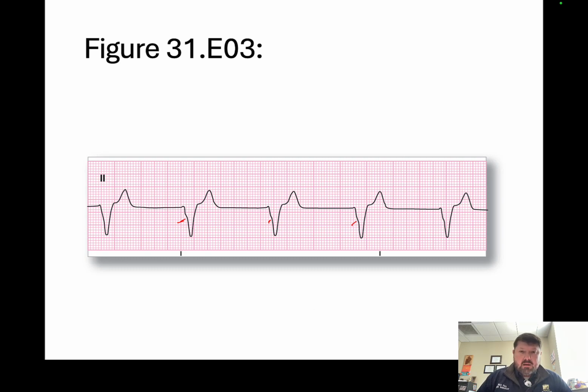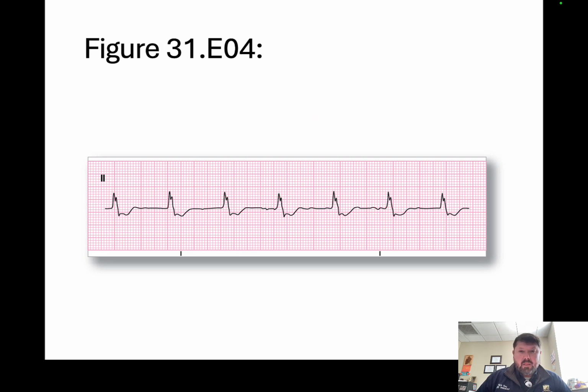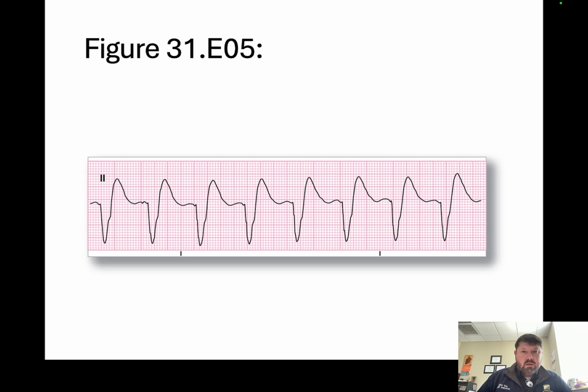So we've got another idioventricular. Wide complex with a rate of 70. So we've got accelerated idioventricular. Same thing here at a rate of 80, accelerated idioventricular.